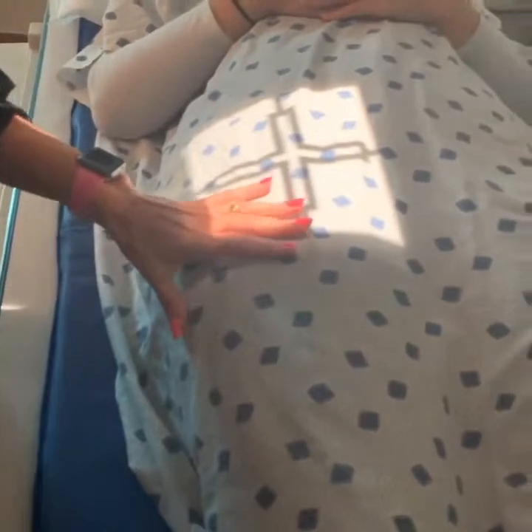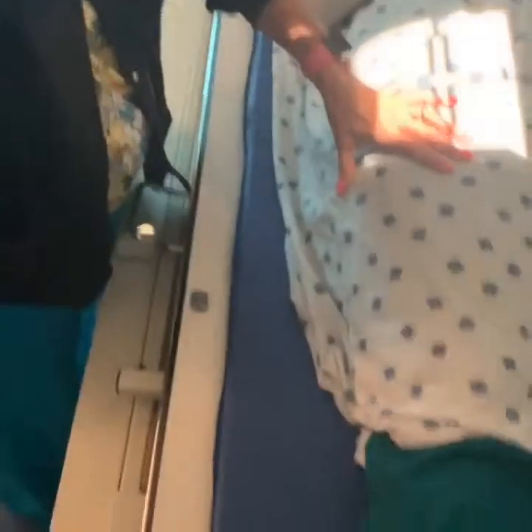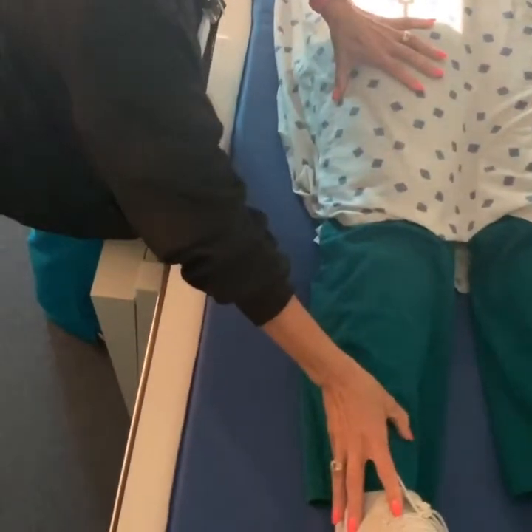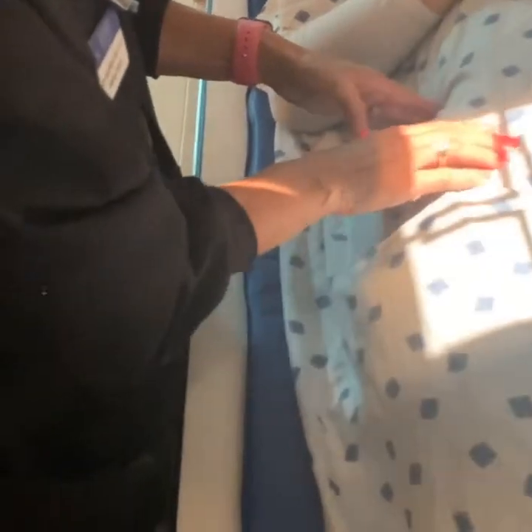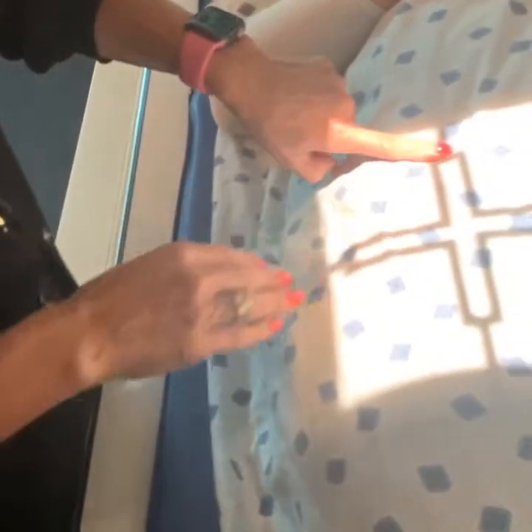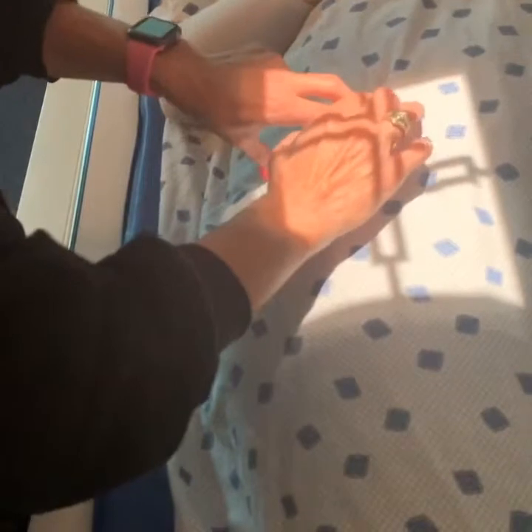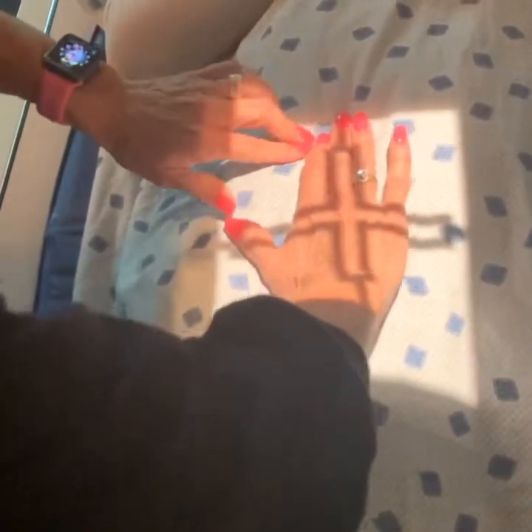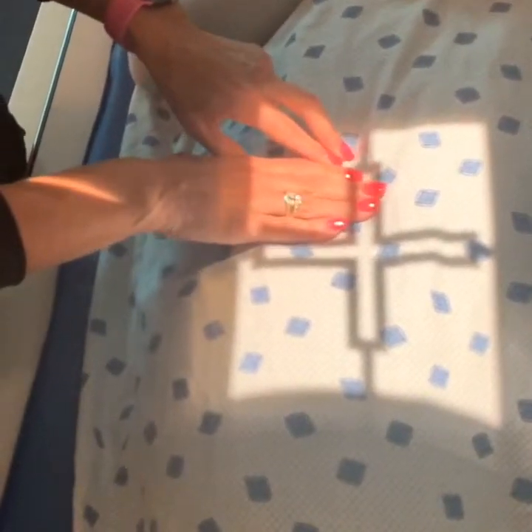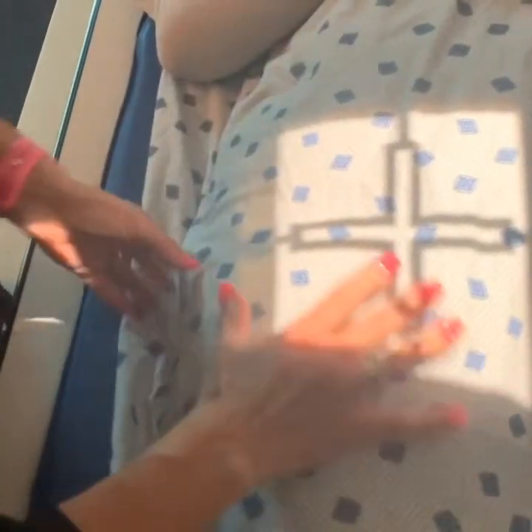And this one, I'm gonna rotate her foot in 15 to 20 degrees to place the femoral neck parallel to the IR. So her leg gets internally rotated. I'm gonna find iliac crest, and then I'm gonna find ASIS. Okay, so ASIS is right here. And on this one, we said that it's 1 to 2 inches medial to ASIS and 3 to 4 inches down. So there's ASIS. 3 fingers is 2 inches. So I'm gonna come about an inch. And then 3 to 4 down. That's 2. That's probably right in between 3 to 4. So let's say I was gonna do that.